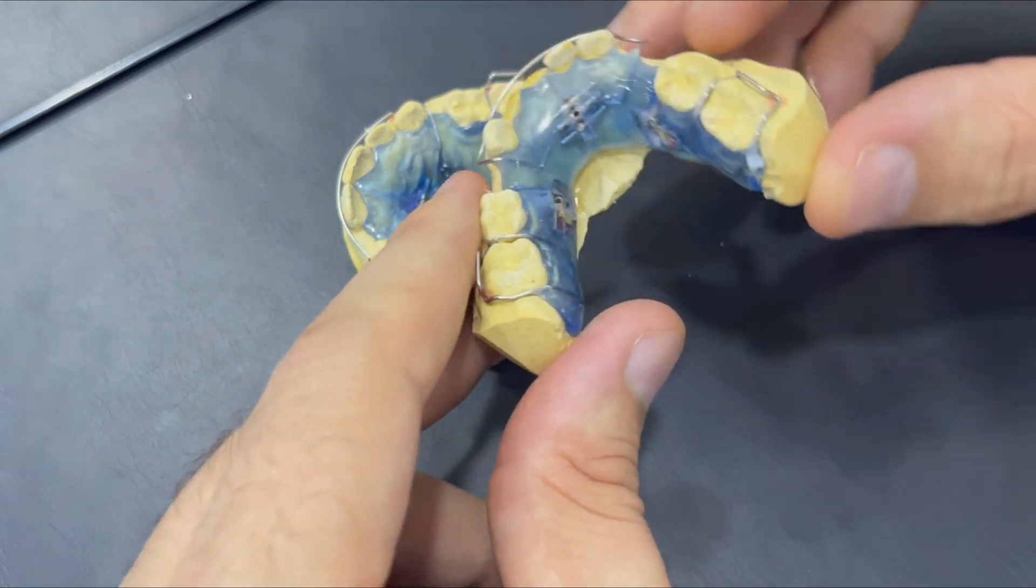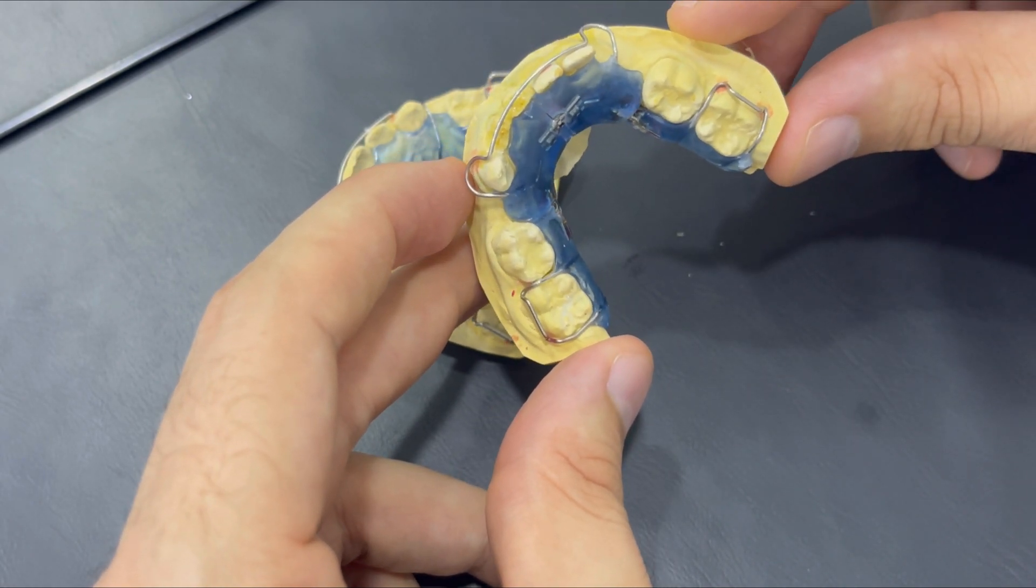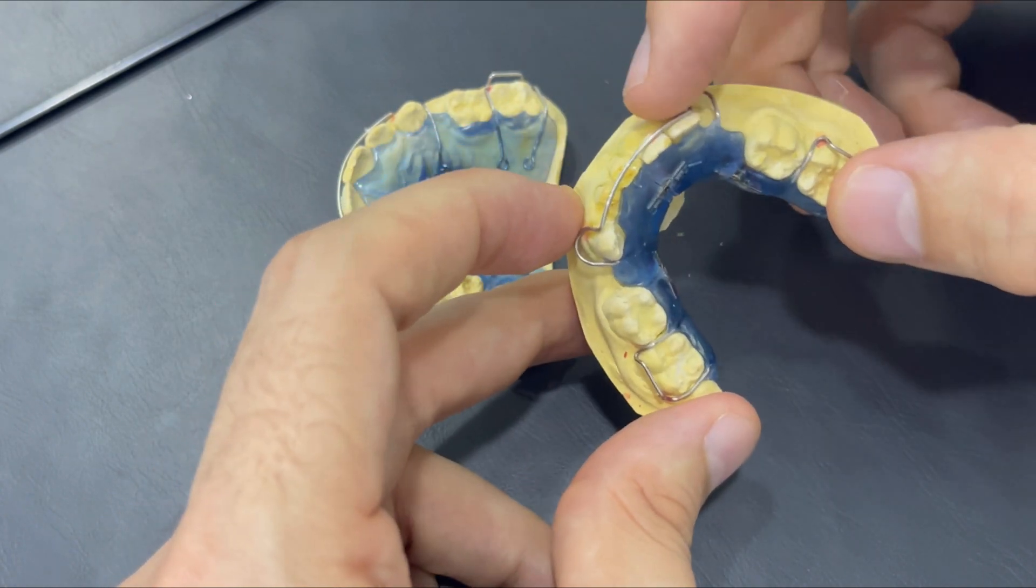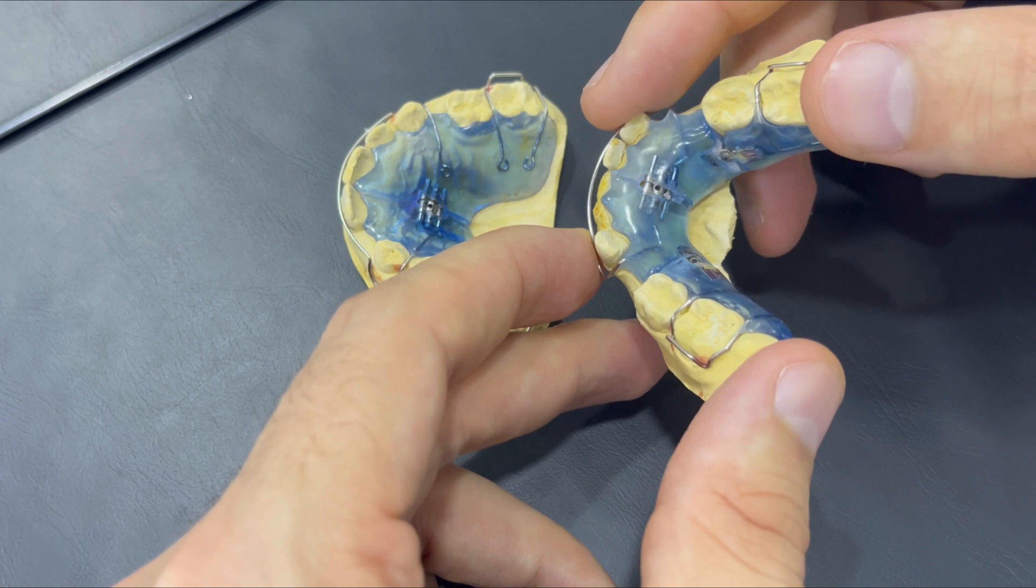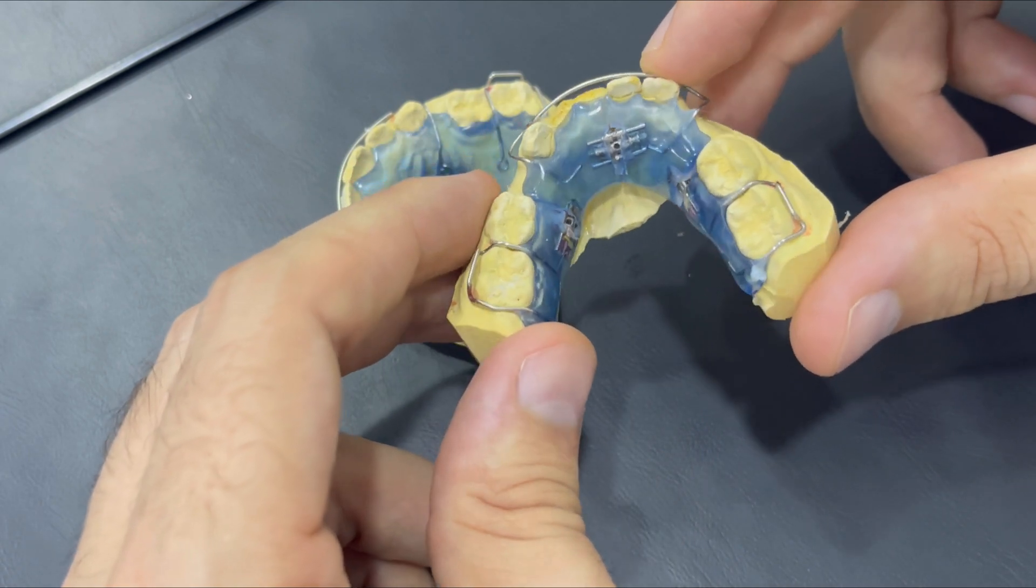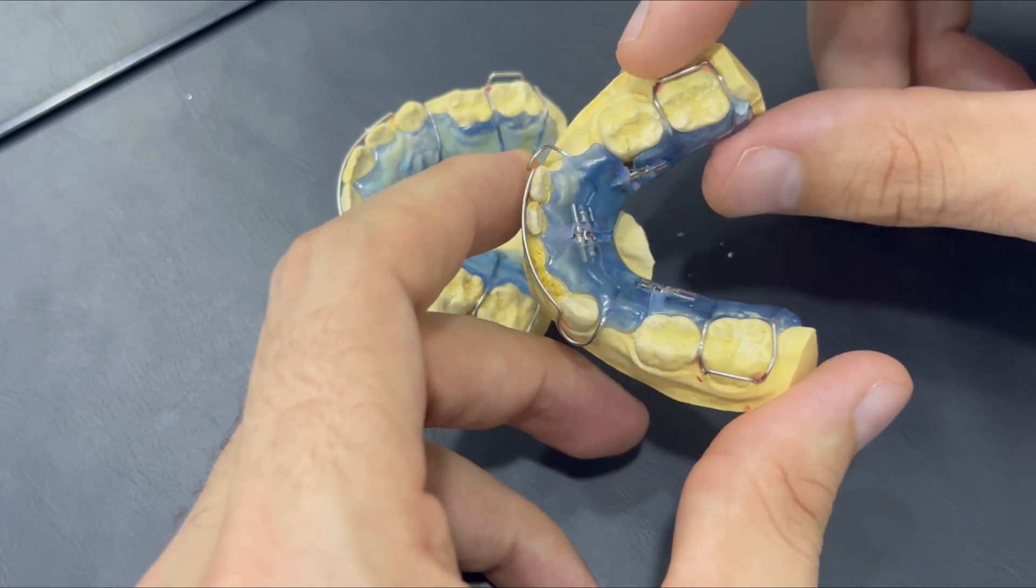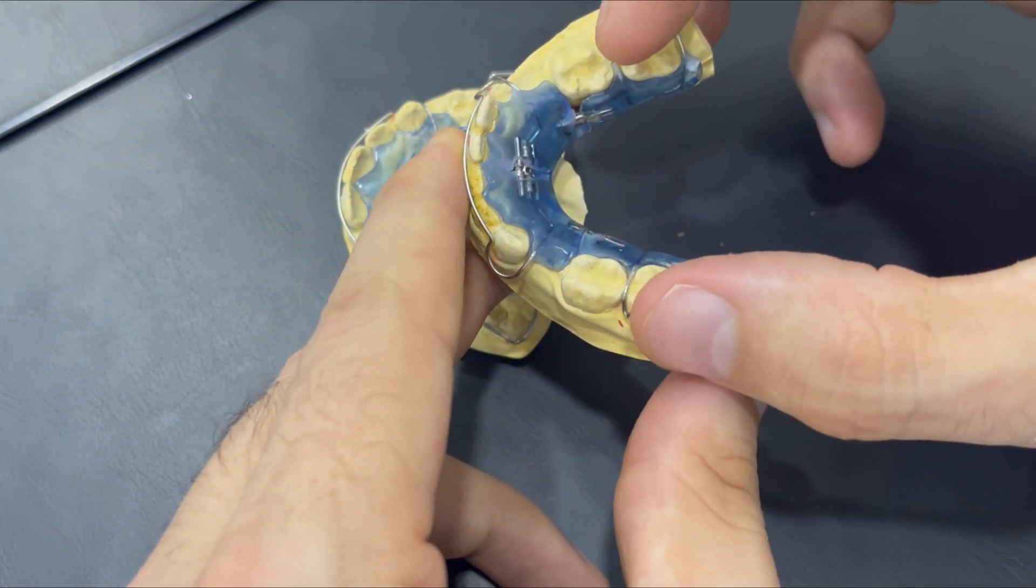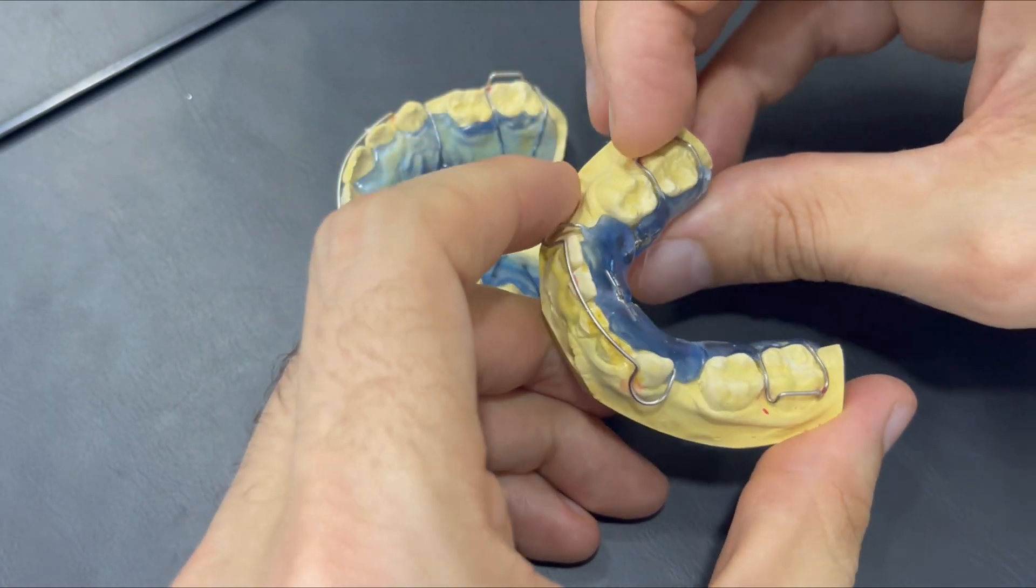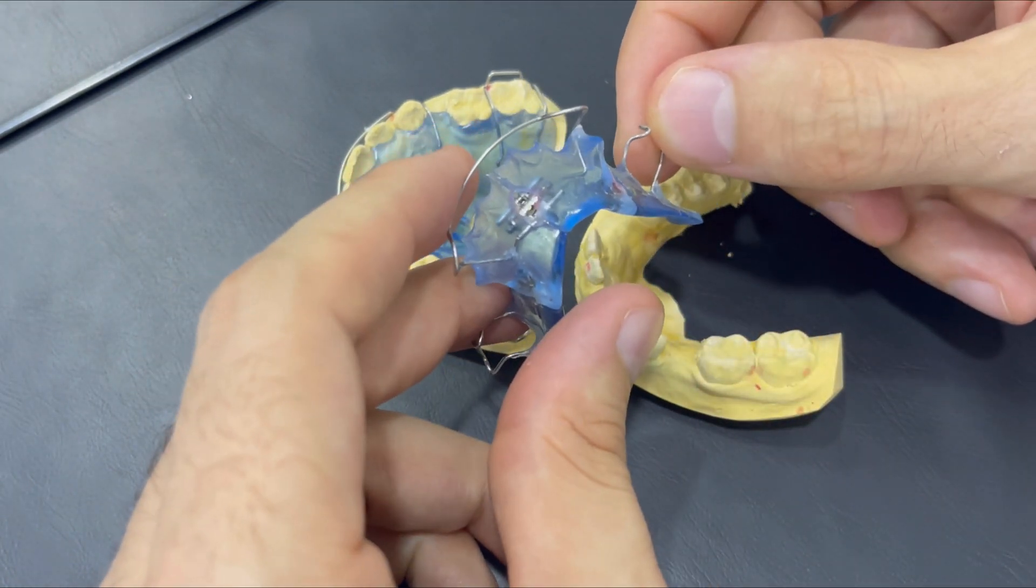For the lower appliance here, as we see again, we have three screws which is very useful to expand in the horizontal way and in the sagittal way. Because for this patient, we don't have enough space for the full permanent teeth eruption. Thus we are creating space and helping the future braces treatment to be more easier.